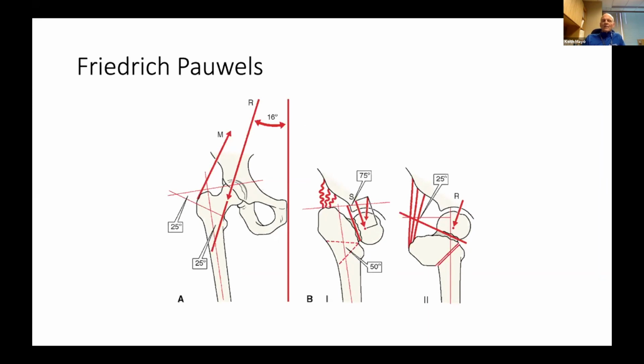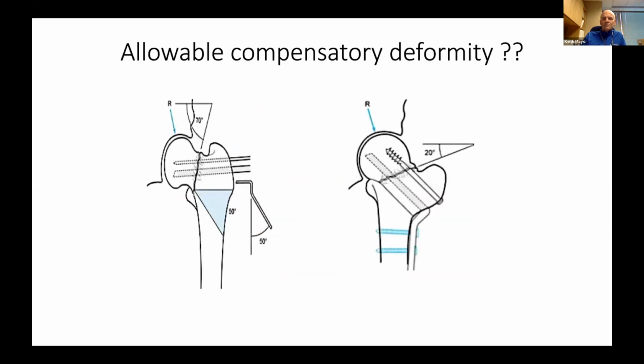And so you have this situation that in the early days, they had many of these that were treated non-operatively with complete shear forces across. And the idea was then you could convert shear to compression, just like we saw in the original introduction slides. The early osteotomies were fixed with tension bands, and so this was a relatively insecure fixation, so the corrections were very large and quite distorting of local anatomy.